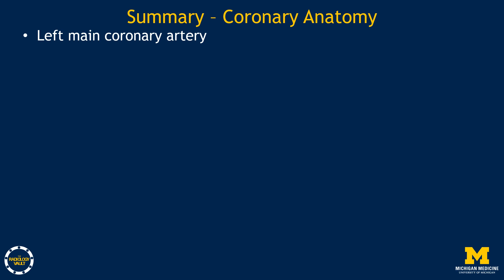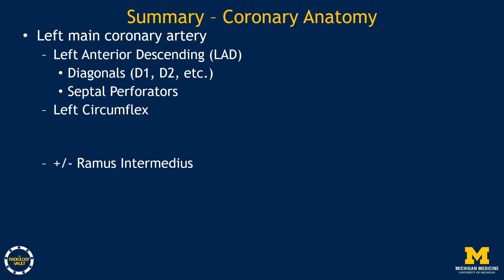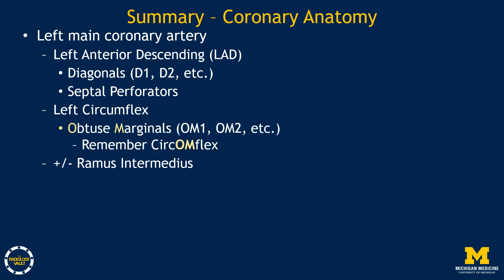To summarize: the left main coronary artery typically bifurcates into the LAD and the left circumflex artery. A normal variant is the left main trifurcation with a middle branch termed the ramus intermedius. Branches of the LAD include diagonal branches labeled D1, D2, etc., and septal perforators identified by their course diving into the septum. The left circumflex artery gives off obtuse marginal branches labeled OM1, OM2, etc. A helpful mnemonic: think of circumflex with OM in the middle for obtuse marginal.